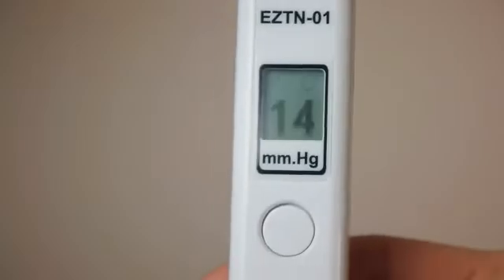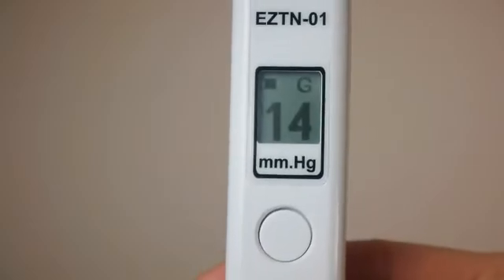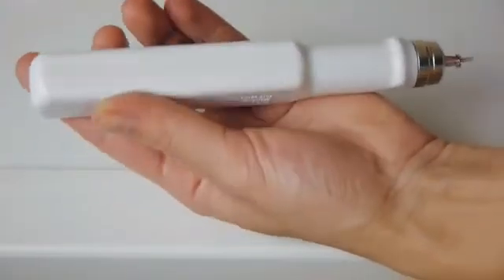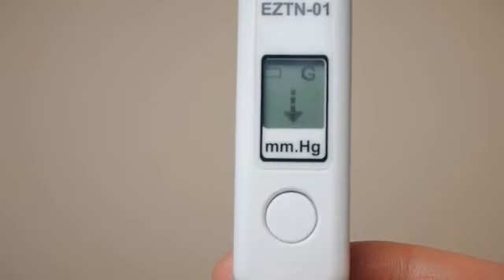To do this checkup, gently insert the device tip all the way down into the tester. 3 measurements should be taken. The deviation from the value specified in the operating manual should not be more than 2 units. Clean the tonometer from dust and dirt when needed. If you see a dead battery symbol on the display, replace the batteries.